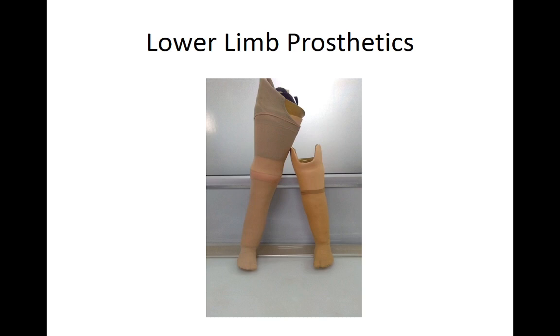For cleaning purposes, we ask the patient to use only a light Dettol solution, wipe it all around the socket part, and pour some talcum powder so that no fungal growth happens within the socket. Because if there's fungal growth, there will be skin irritation and damage of the skin. So we ask the patient to wipe it clean with slight Dettol solution, then pour talcum powder and sometimes put it in the sunshine, so that it kills all the bacteria and the fungus.